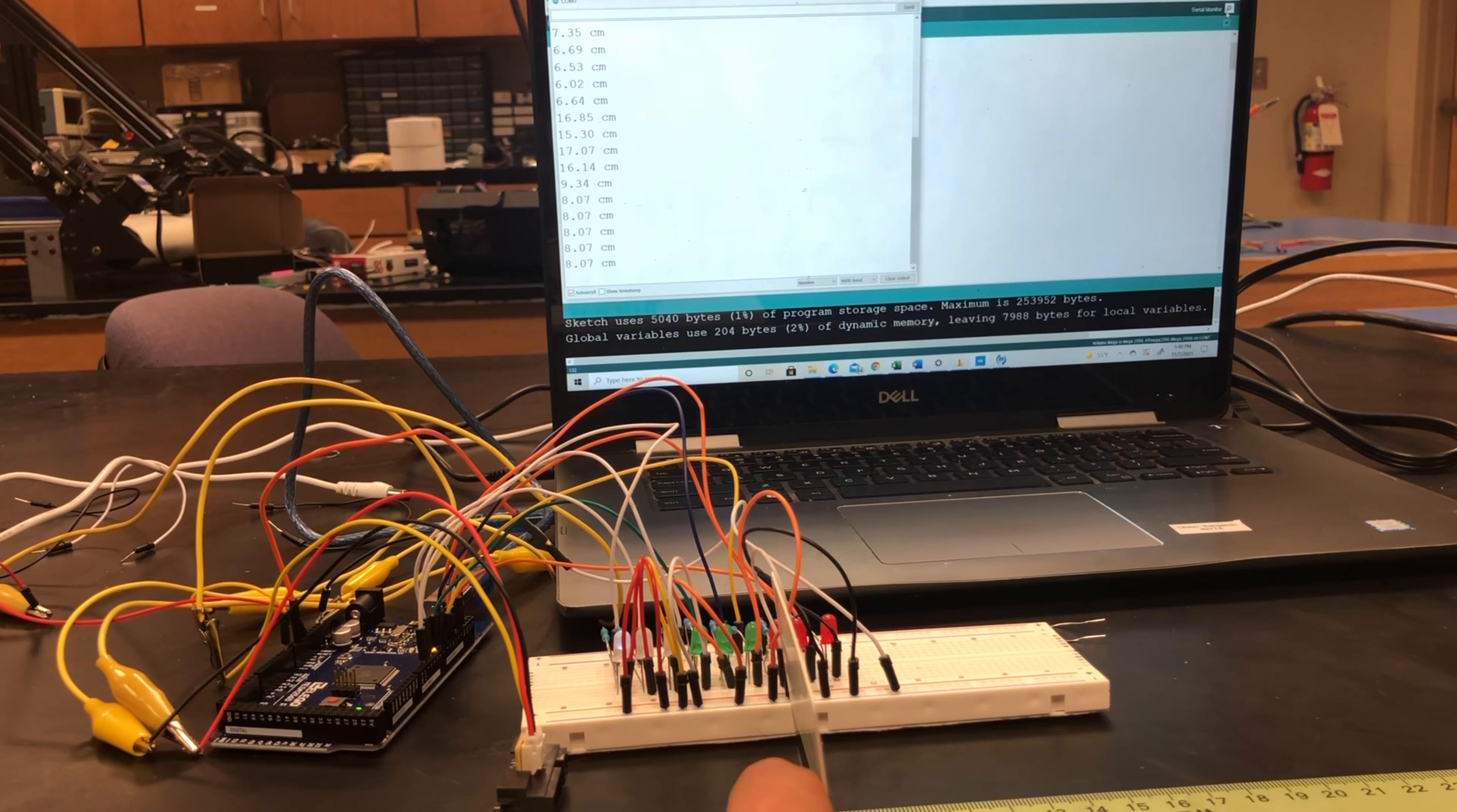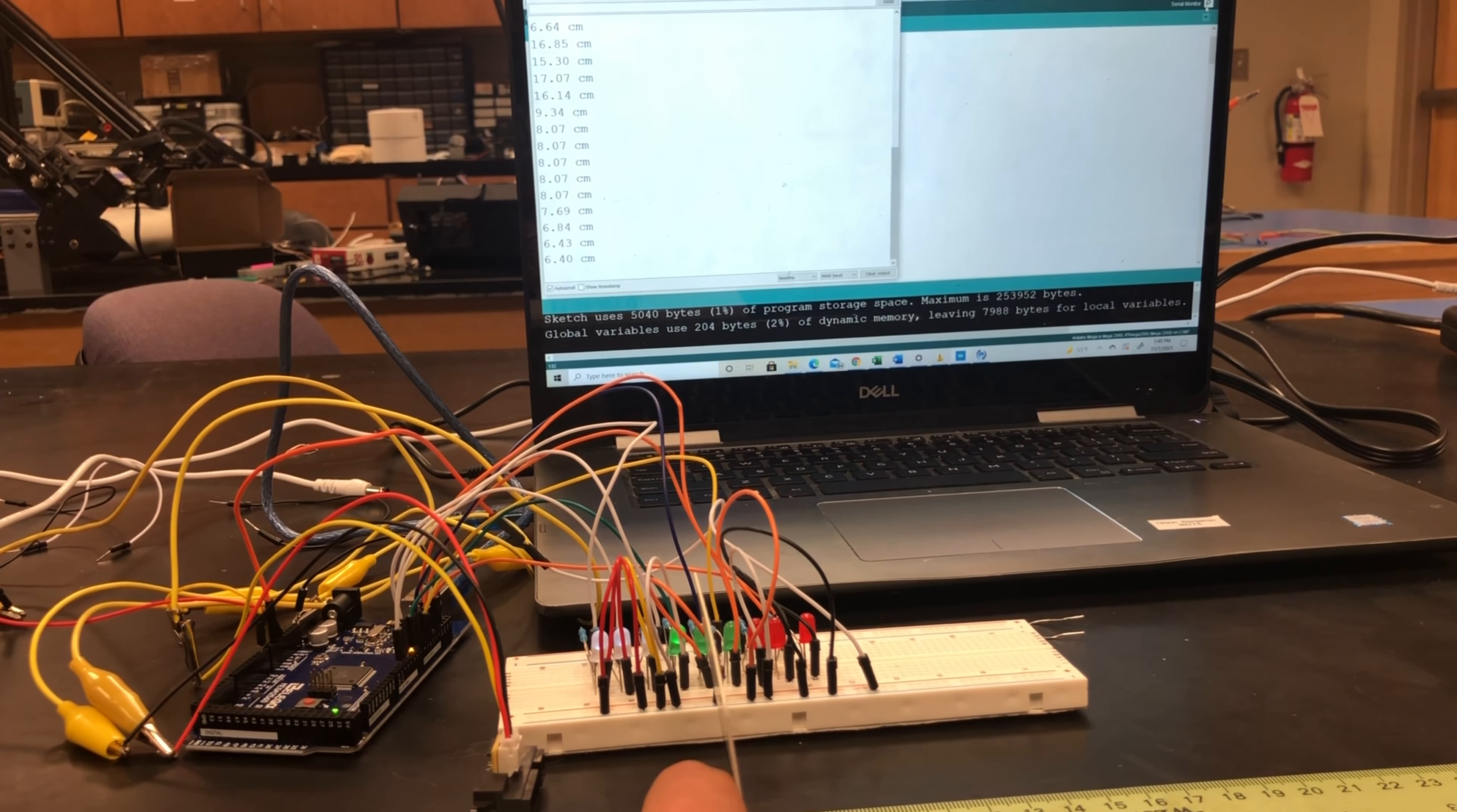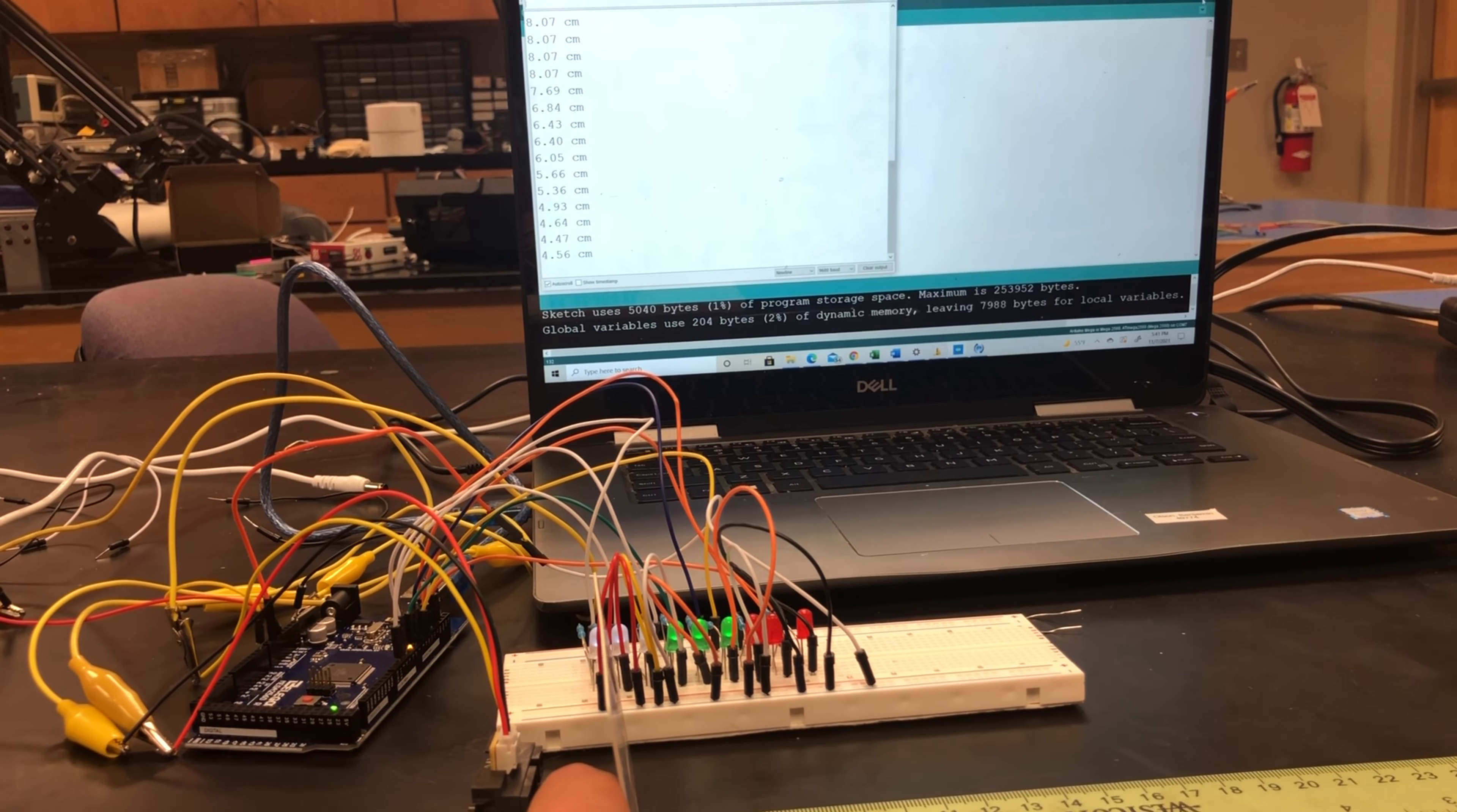Next, the accuracy of the sharp proximity sensor was tested as shown. Notably, it was found that the sensor is most accurate between 5 and 10 centimeters. This information is important as the sensor should be positioned at a distance so that the compressions are occurring in this range.